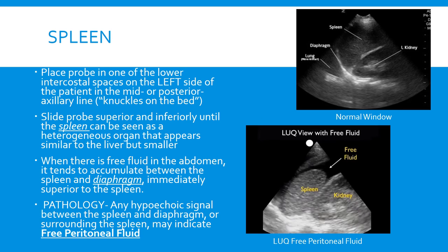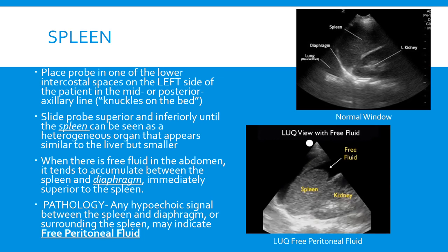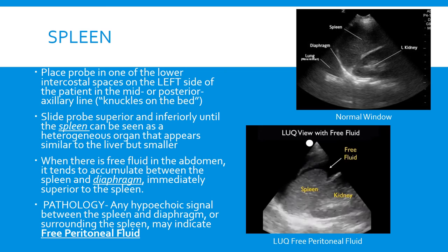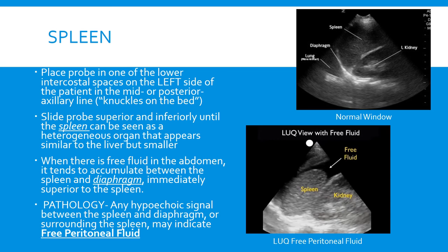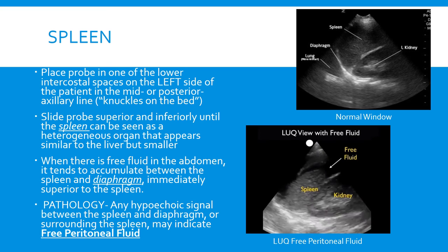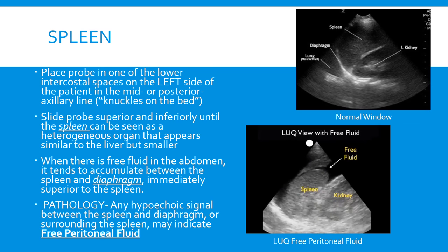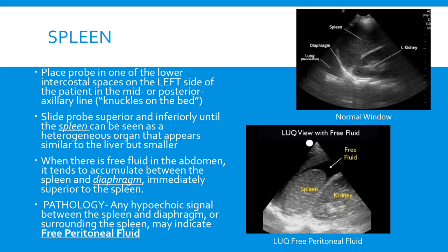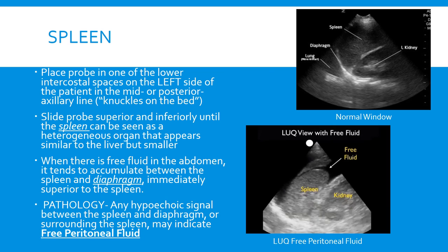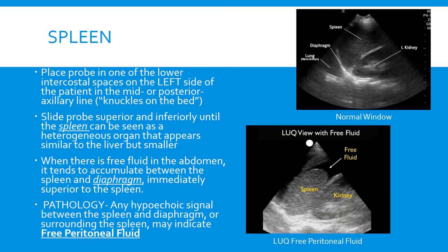Now we're going to move the probe to the left side of the patient to take a look at the spleen. We place the probe similarly to how we placed it for the liver, only on the left side — mid or posterior axillary line, knuckles on the bed. When looking for free fluid around the spleen, fluid tends to accumulate above the spleen between the spleen and the diaphragm, which is different from the liver where it accumulates between the liver and the kidney.